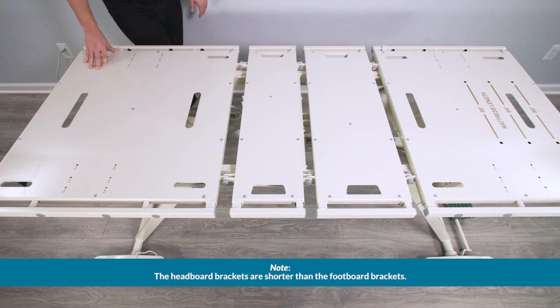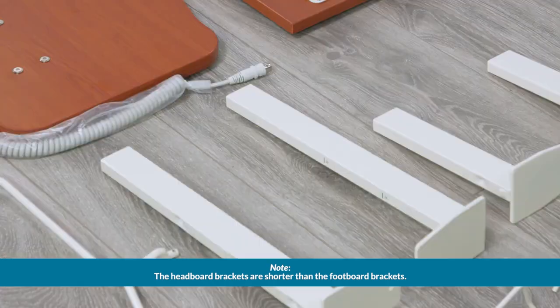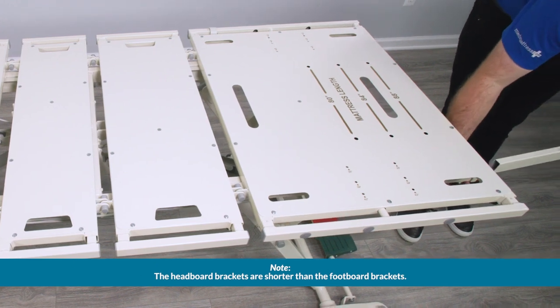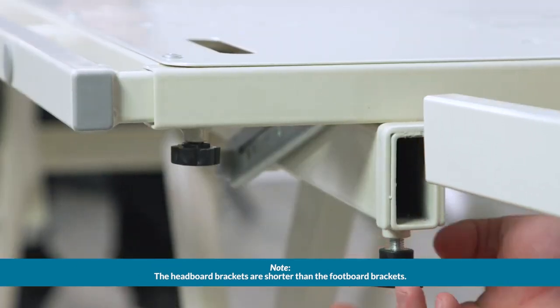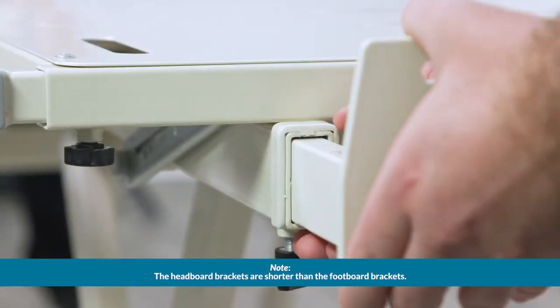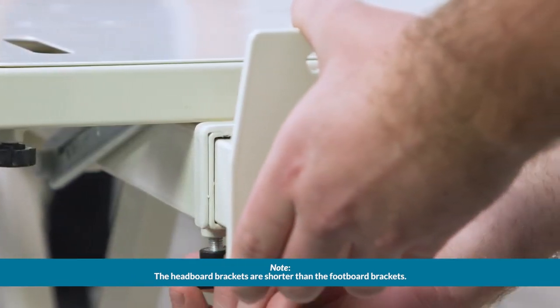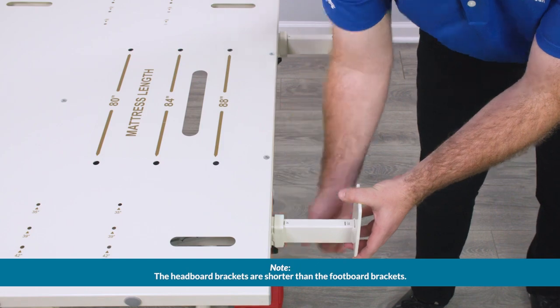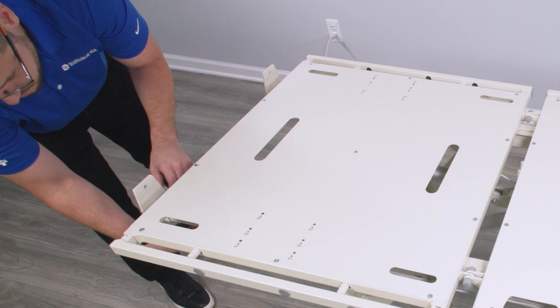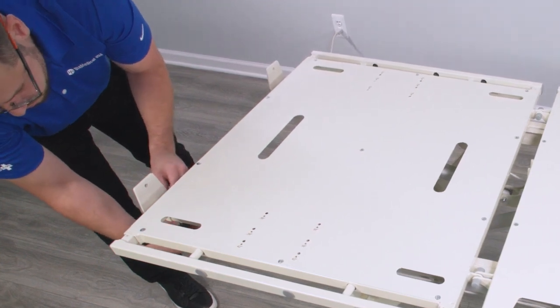With the bed already in the highest position and locked in place, begin assembly with the mounting brackets. Unscrew the two black knobs on the underside of the bed assembly. Slide the footboard mounting bracket onto the bed and secure by re-tightening both of the black knobs. Install the headboard mounting bracket on the bed and secure by tightening both of the knobs.